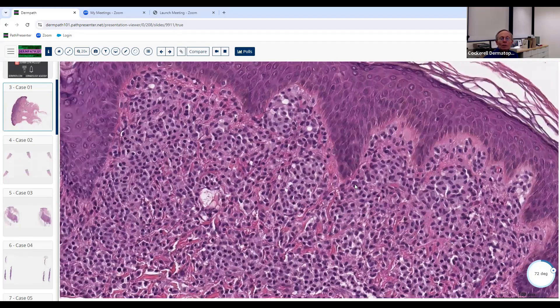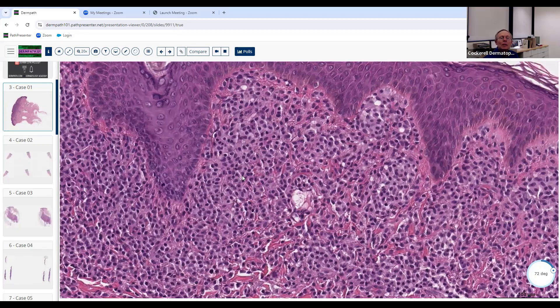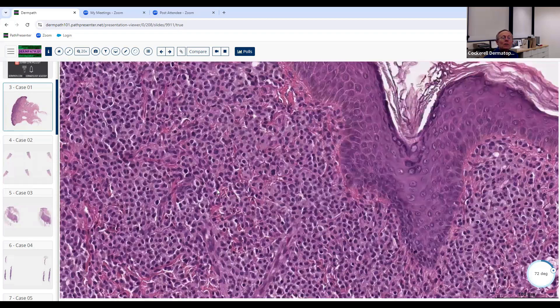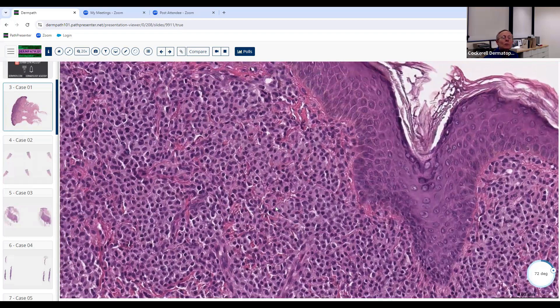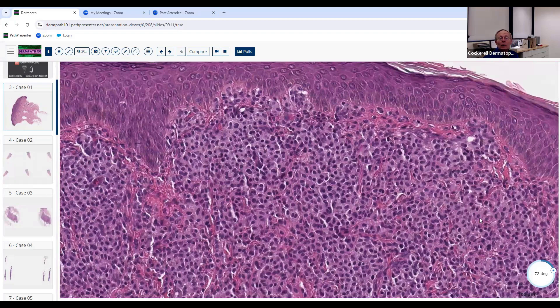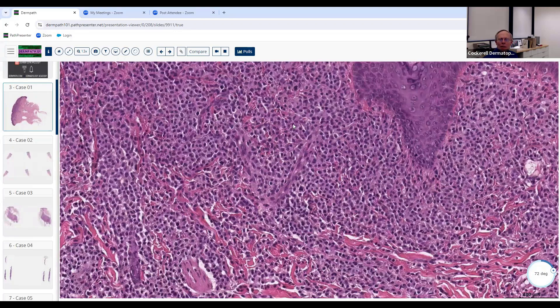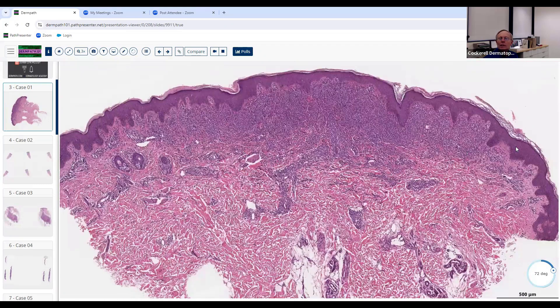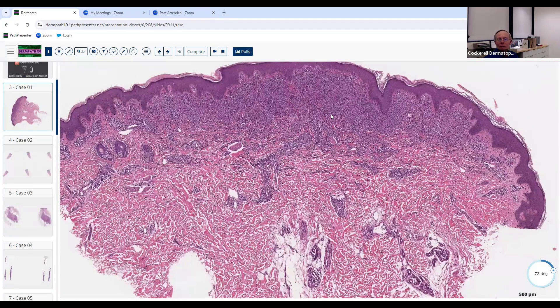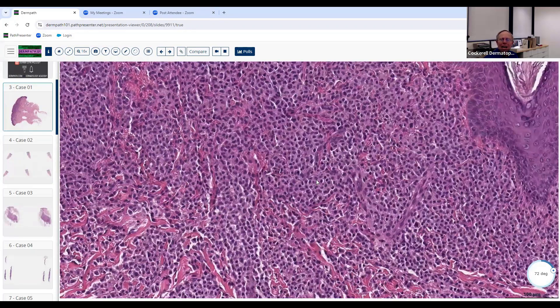The individual cells are beautiful examples of mast cells. The cells have granular cytoplasm that's slightly purplish. In cross-section they look like fried eggs — round central nuclei with surrounding cytoplasm. In longitudinal section they look like hot dogs, very elongated. Every single cell here is a mast cell. If you inject lidocaine into the lesion it also degranulates mast cells, so allergists inject in a ring fashion around the lesion rather than directly into it.